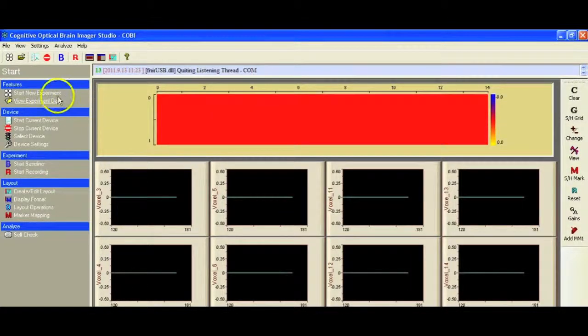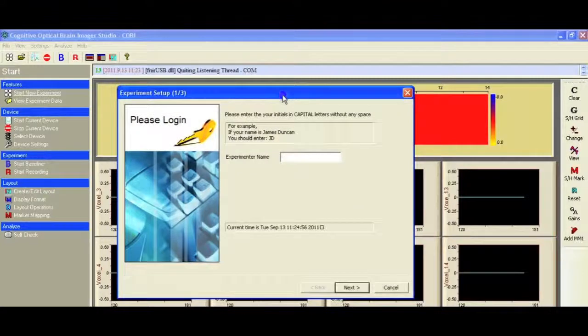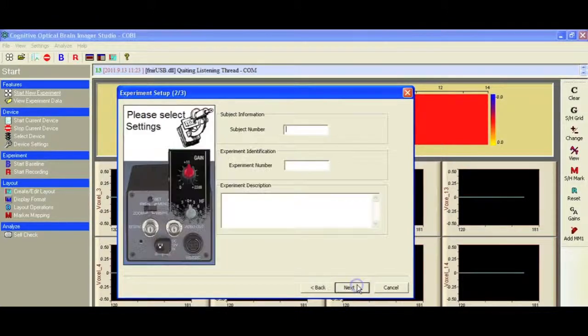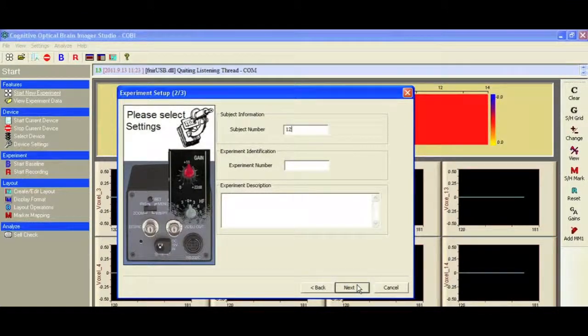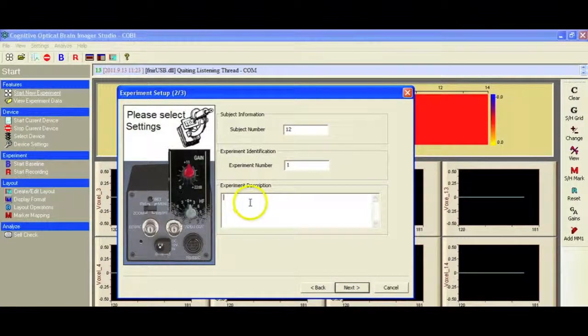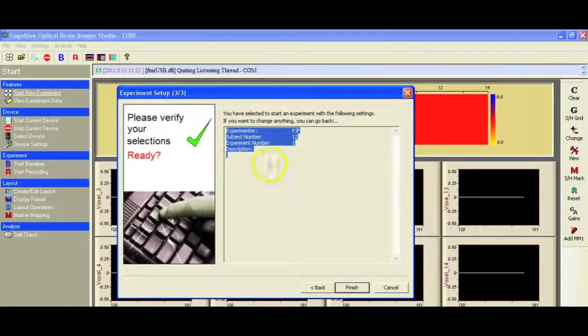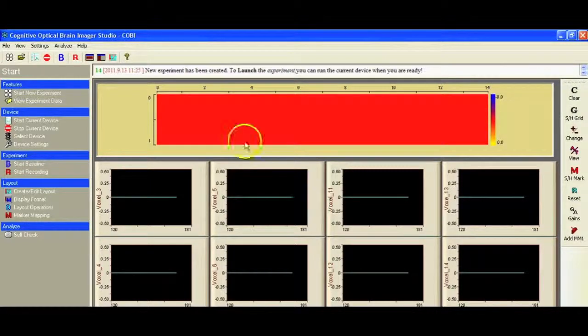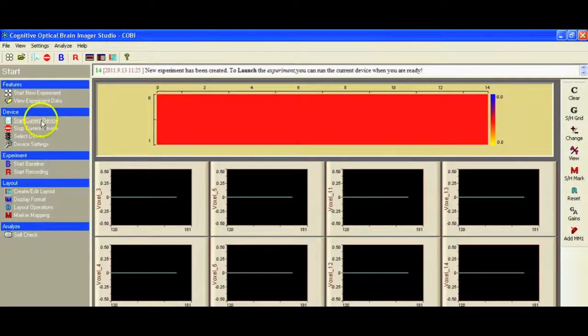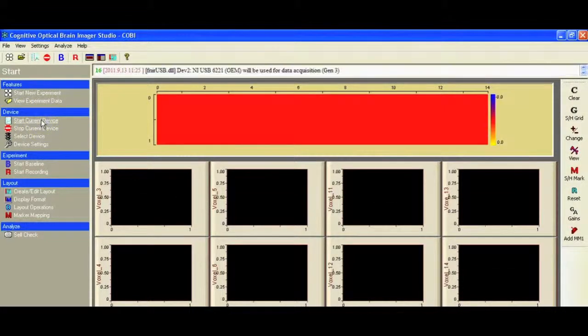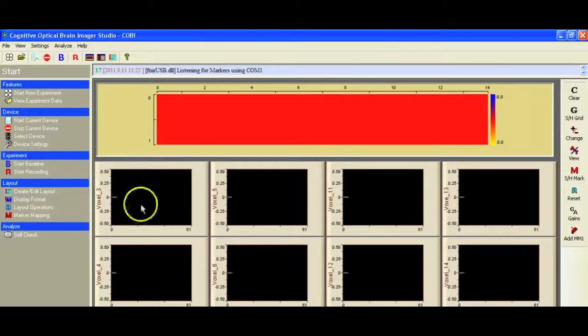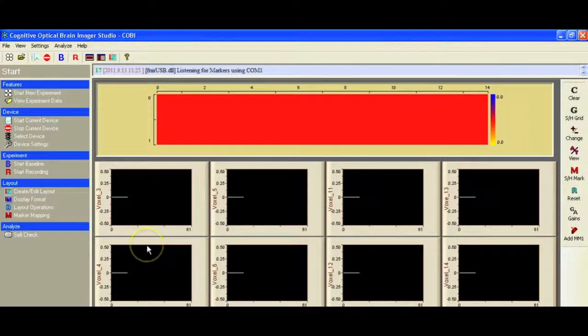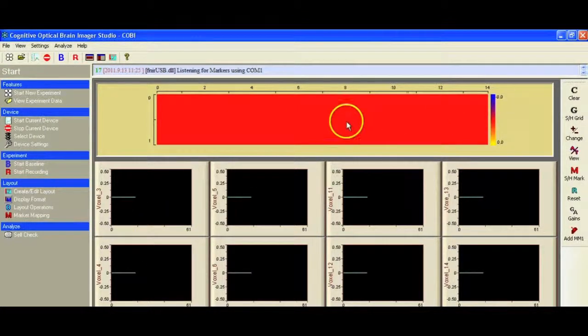Now what we're going to do is start a new experiment. The first thing we have to do is put in our experimenter's name. I'm just going to put some initials in there. Subject number, experiment number, and we can put a description down here if we want. Now we get a summary of our settings. At this point we're ready to start the device. Now we can see each of the 8 channels displayed on the screen, and we can see our heat map.